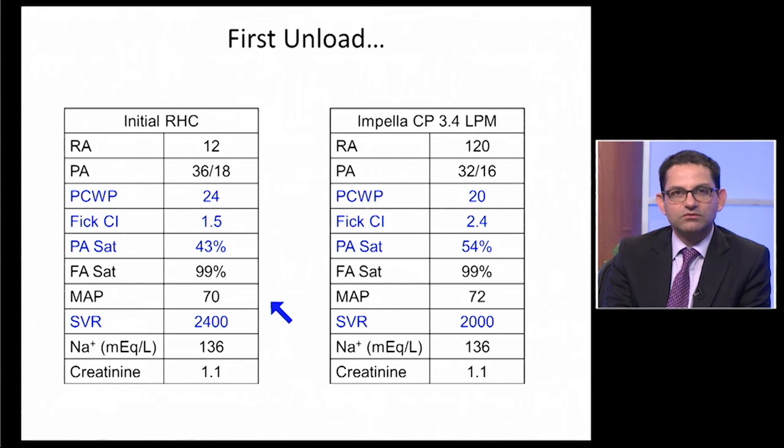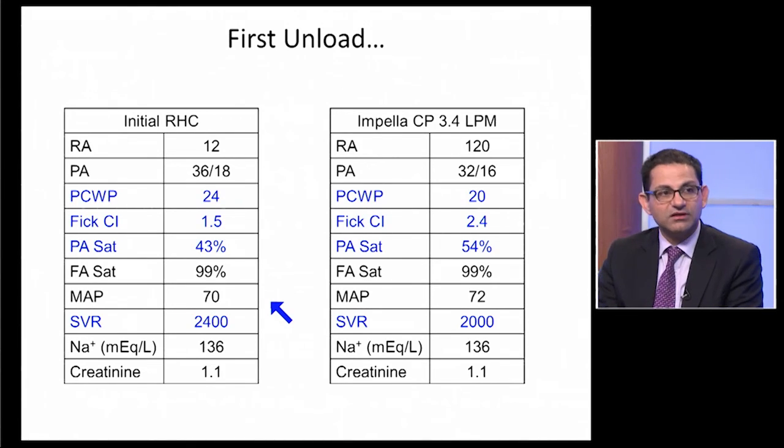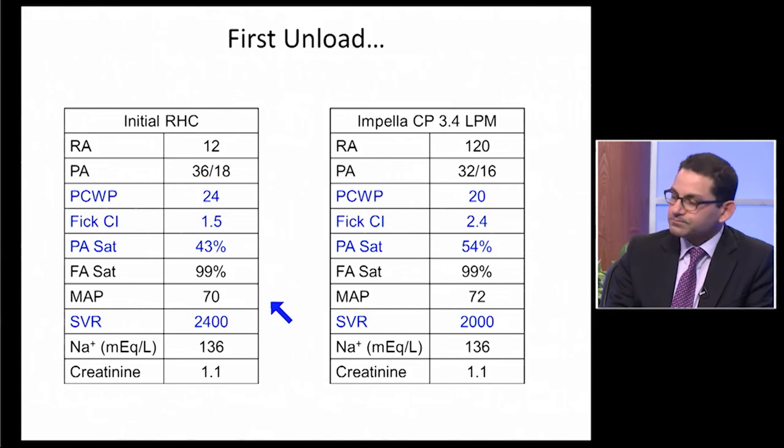So now that we've got the right heart cath data, we can check off the shock metric. We've confirmed that we're in cardiogenic shock, and now all of a sudden the priorities change in terms of how we manage this acute MI patient. The priority in the majority of AMI patients is to reperfuse as quickly as possible. Now my priority shifts to taking care of the hemodynamic embarrassment before we start to reperfuse and potentially cause reperfusion injury.